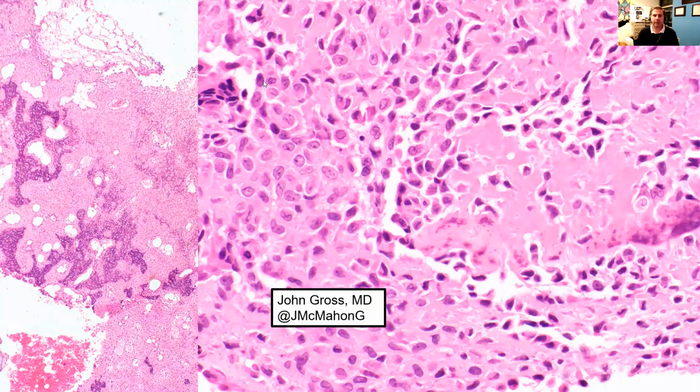And then another very, very rare variant is chondroblastoma-like osteosarcoma. Seen here on the far left, you can see that there's this purple mineralization and an otherwise very pink tumor. And on the right, this is a higher power view showing these epithelioid cells that are variably chondroblastoma-like, some of which even have kidney bean, reniform shaped nuclei, some of which even have nuclear grooves.